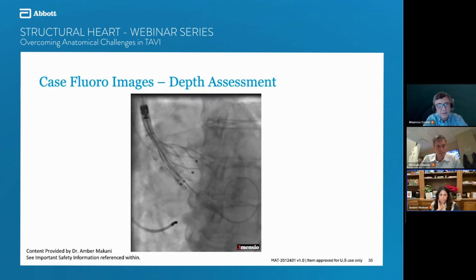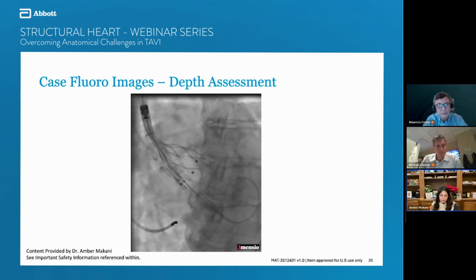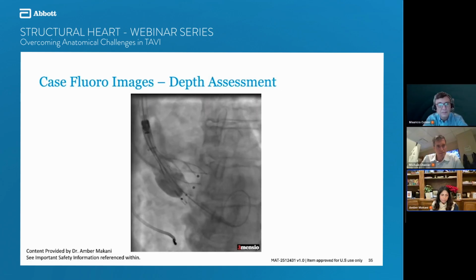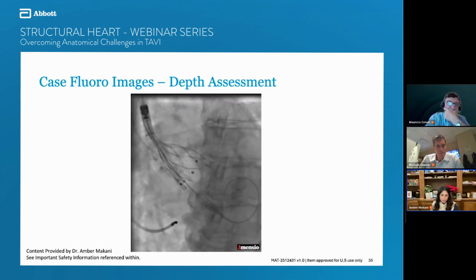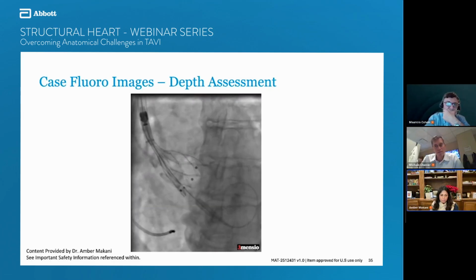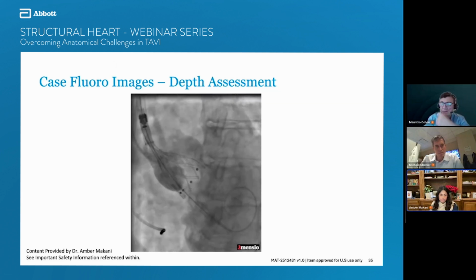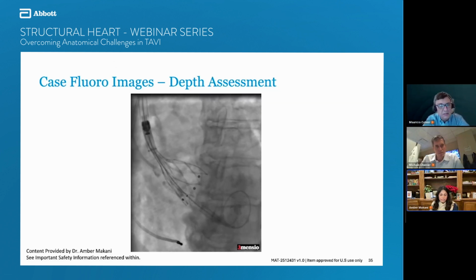The Vision markers, you can see, I find them to be by and large the most well visualized markers in terms of being able to do appropriate depth positioning here. And so the attempt is always to line up the Vision markers at the pigtail, or the bottom of the pigtail. And you can see our 80% imaging here. Next slide.